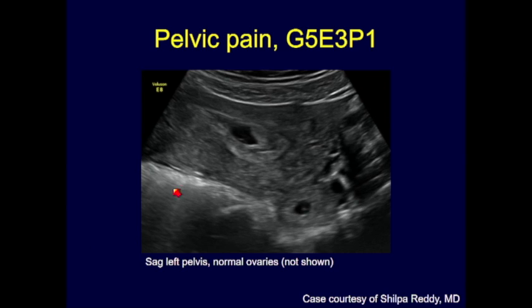So if you look here, there is a sac-like structure. She had an IUP, and then in the pelvis, she also had another sac-like structure. Now this was read out as IUP next case.